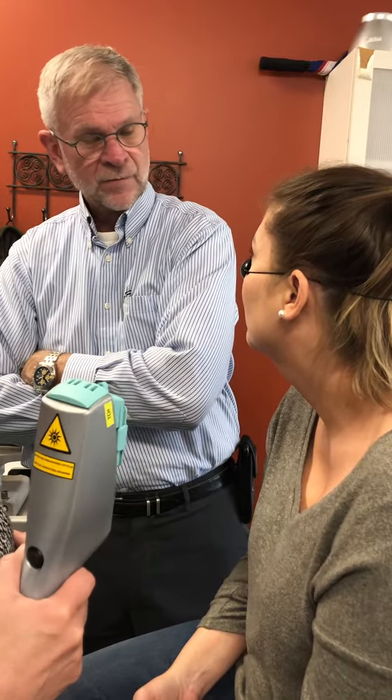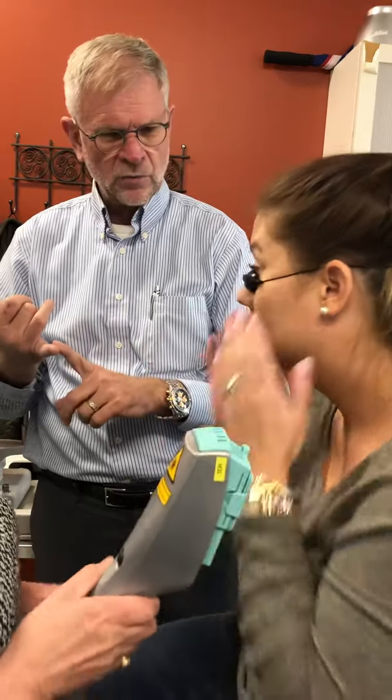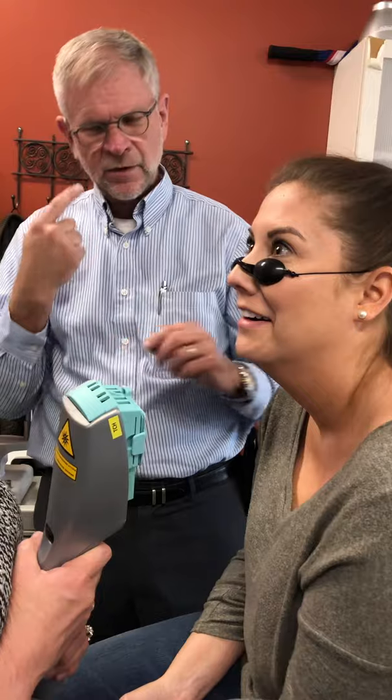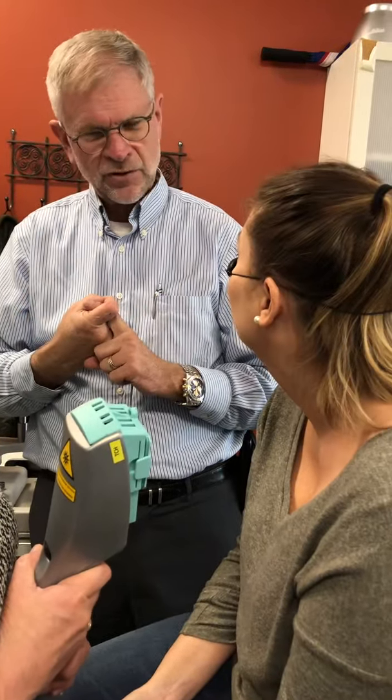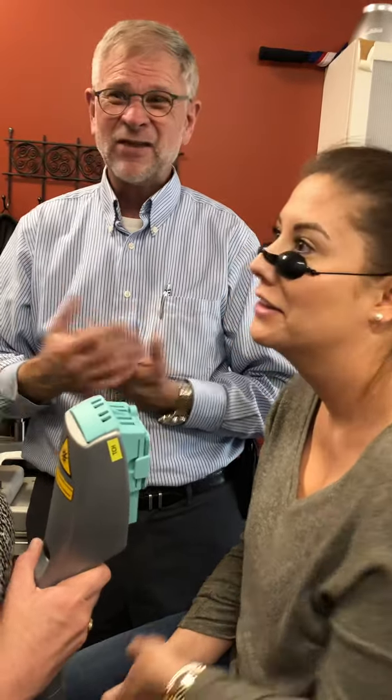I'm videotaping. Number 1, this is going to be the brightest light you'll ever experience. Okay? You're not going to see it because we're protecting you so that you don't get what they call a retinopathy. But it's going to go through your skin. It's going to go through your melanin. It's going to go through your bone, and your brain's going to perceive it. And she might go, whoa, okay? On the first shot. Everything after that is like, okay, because they just didn't expect it. Not scary.